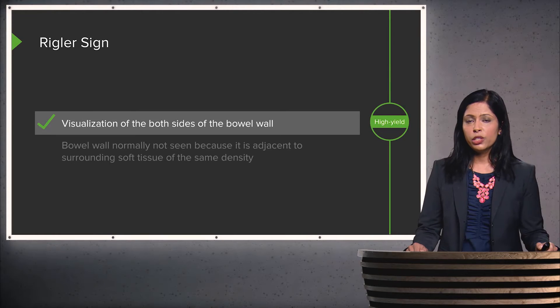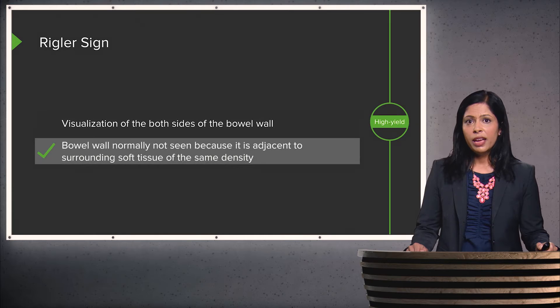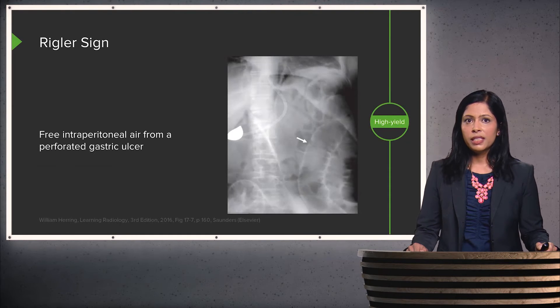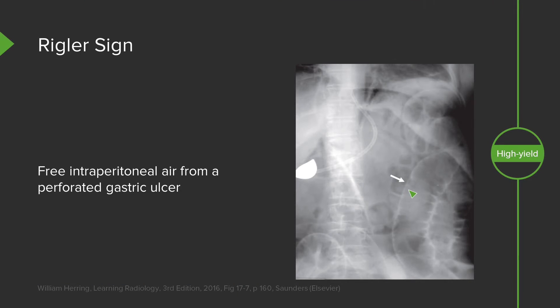The Riggler sign is visualization of both sides of the bowel wall and is an important sign of free air. The bowel wall is normally not seen because it is adjacent to surrounding soft tissue of the same density. However, if you have air on both sides of it, you can now see the bowel wall. This example of the Riggler sign is from free intraperitoneal air due to a perforated gastric ulcer — you can see the bowel wall, air within the bowel, and air outside of the bowel.